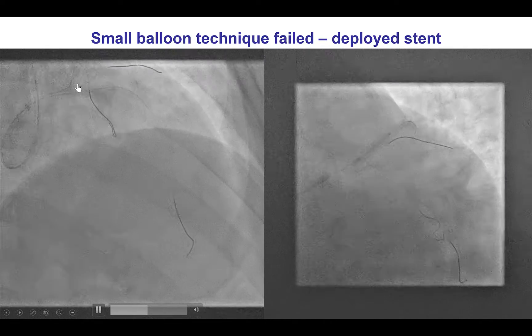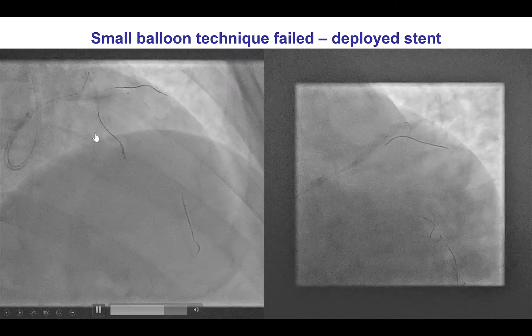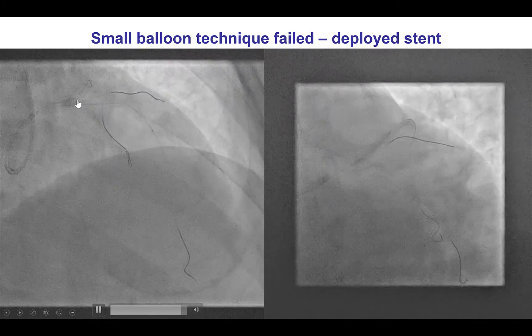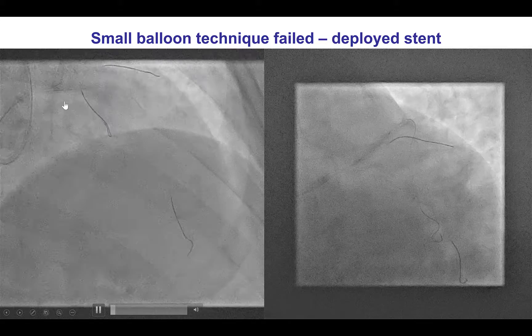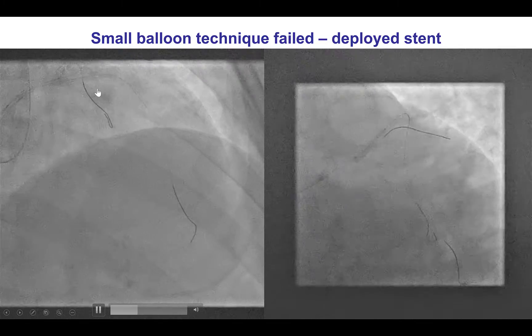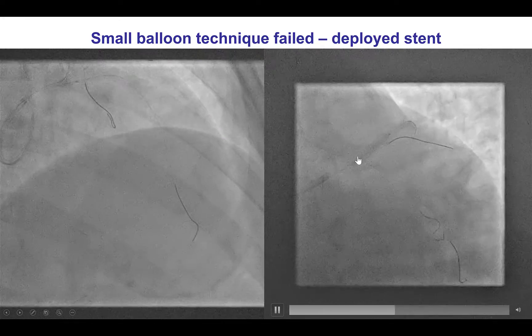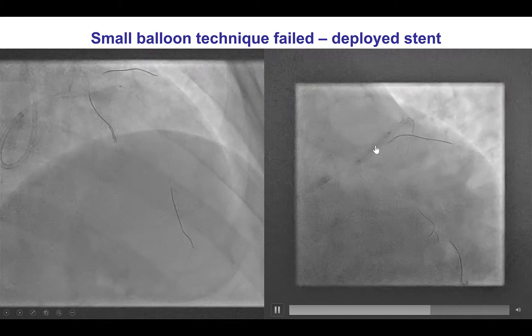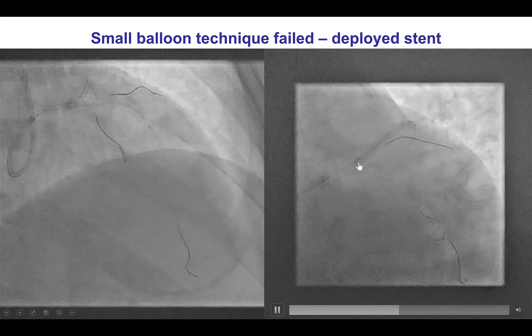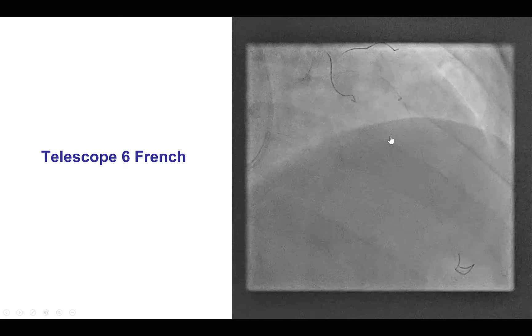We decided not to proceed with further retrieval attempts. There is actually a case — case 167 in the Manual of CTO Interventions — in which snaring and forceful retrieval of a stent caused perforation. In this case we decided to deploy the stent by inserting increasingly larger balloons through the lost stent and deploying it inside the previously placed stent in the proximal LAD.